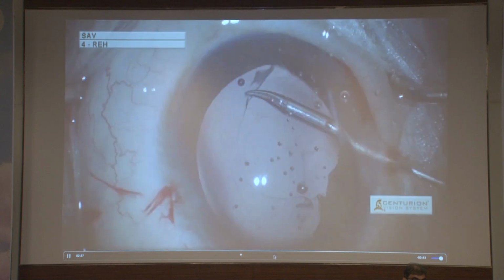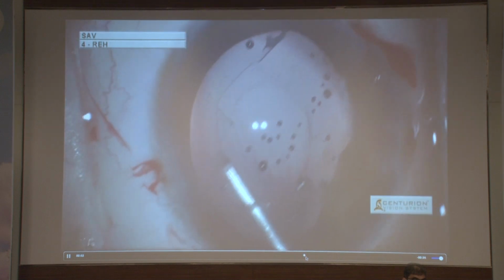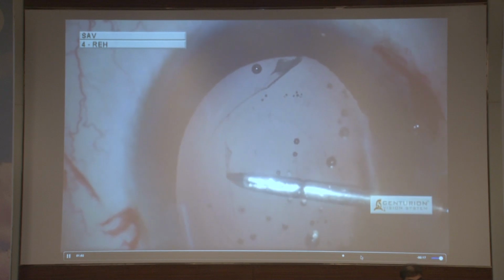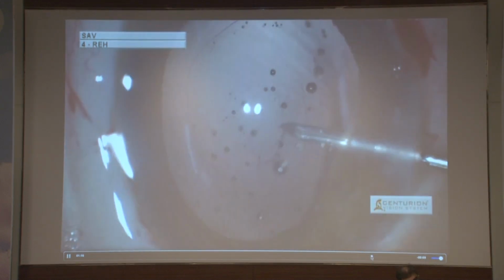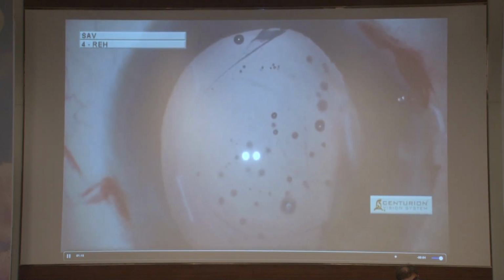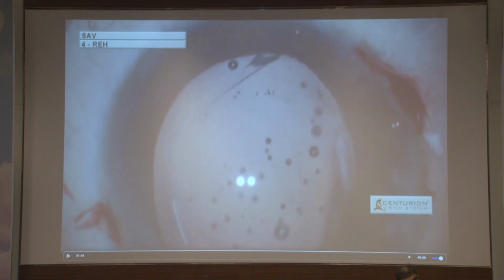with the buttonholing of the optic through the posterior capsulorhexis. So after having done that, I realized that I need to also enlarge the anterior capsulorhexis to an appropriate size, and further extend the posterior capsulorhexis, so that the rhexis is large enough for the optic to pass through it. So now we have this large enough anterior opening and a fairly decent size posterior capsulorhexis opening.